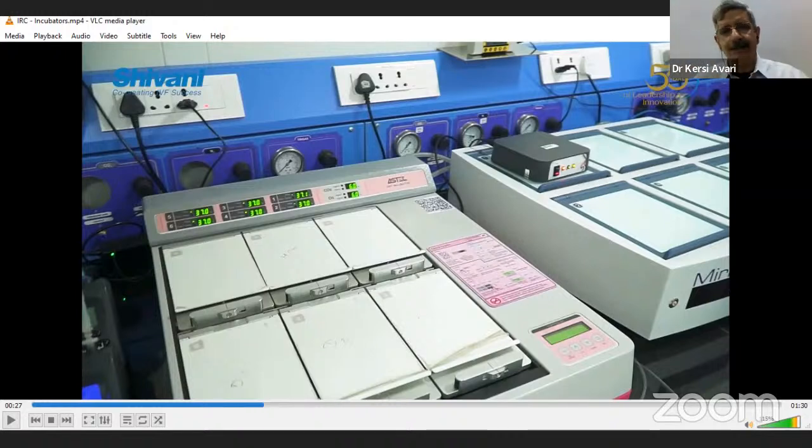In the morning you come, you say everything is fine, because here the monitoring system which we saw in the box incubator is not there. So you are not aware of what happened at night time. You got my point? So nowadays there are alarm systems which are fitted on your mobile phones, just like your in-house CCTV cameras, where you are here, but you can monitor the condition of the room, the security scenario, maybe kilometers away.